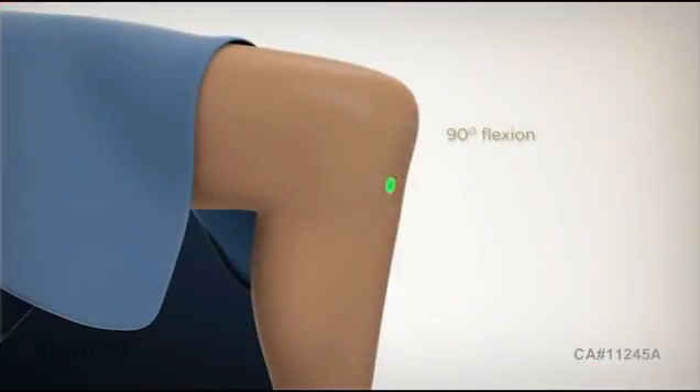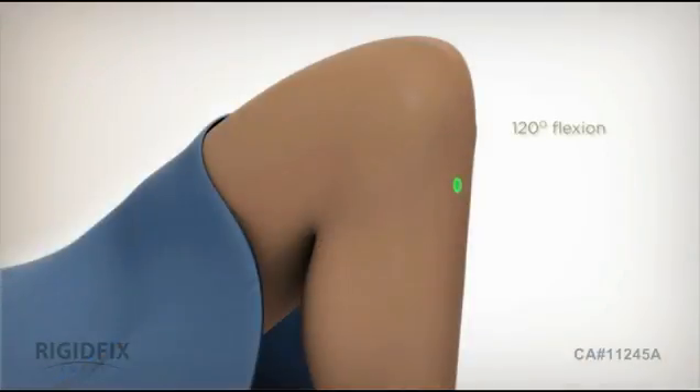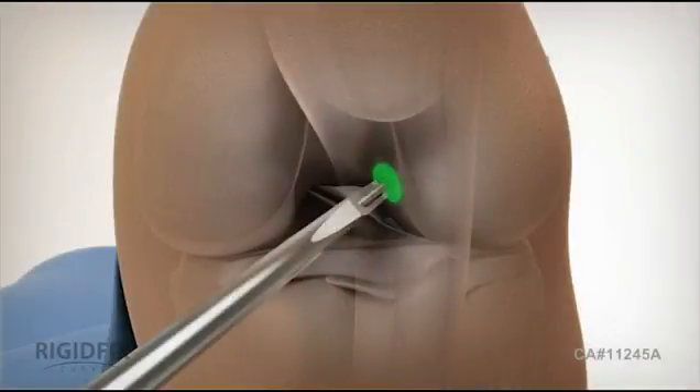With the knee at 90 degrees, use an offset aimer to introduce the guide pin to the center of the native ACL footprint. Prior to drilling, hyperflex the knee to 120 degrees. Make sure the tip of the guide pin is directed to exit above the lateral midline of the femoral shaft to maximize lateral bone stock. Then drill the guide pin into the femur.